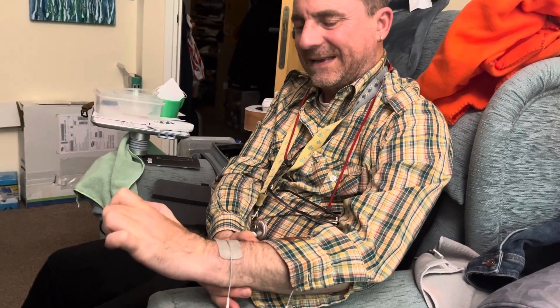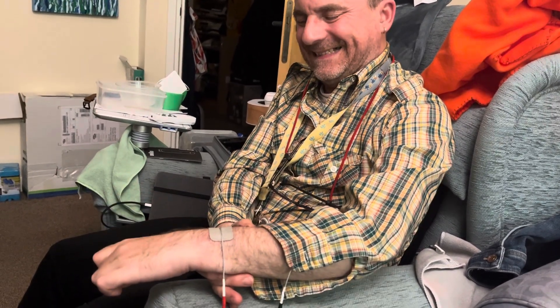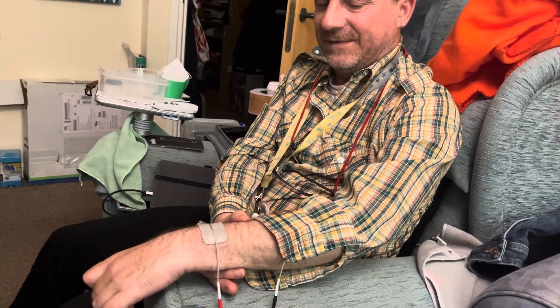I'm trying to go against it and it won't let me. It's gone off. I can just about clench my fist, but apart from that I can't do anything.